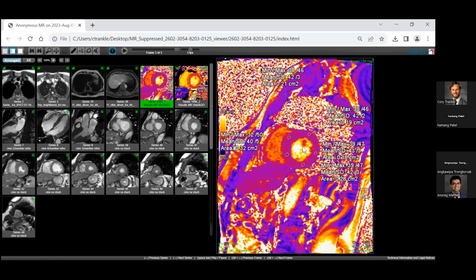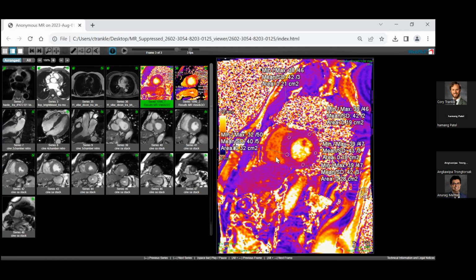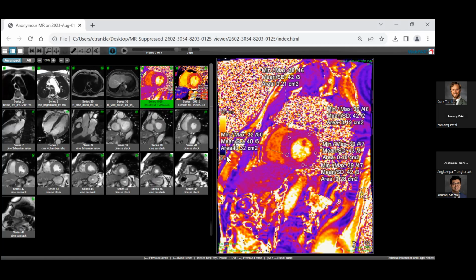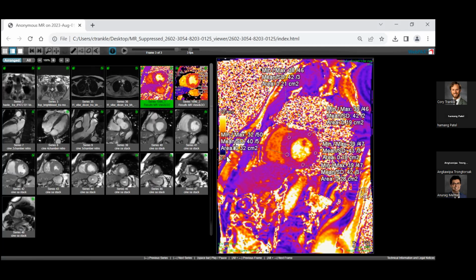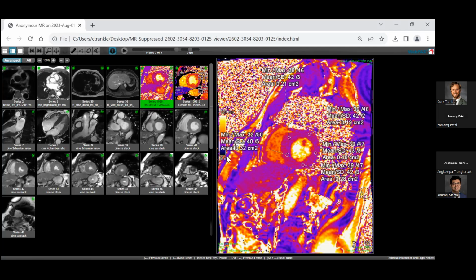Now, if you look on the left side of this magnified color image, there's a little color scale. It's a vertical bar. At the bottom, it says 0 milliseconds, which is black. And then you go all the way up to 120 milliseconds, which is bright white. And this is a T2 map, and we'll talk about what in the world a map means.